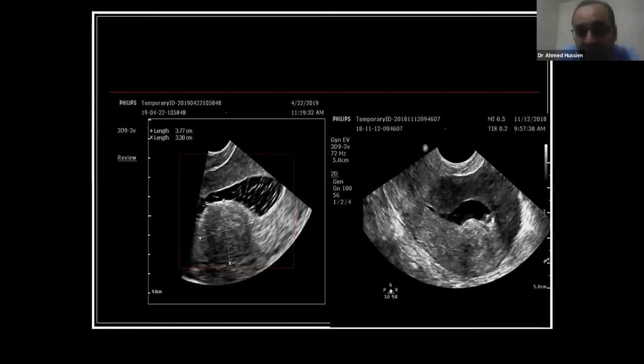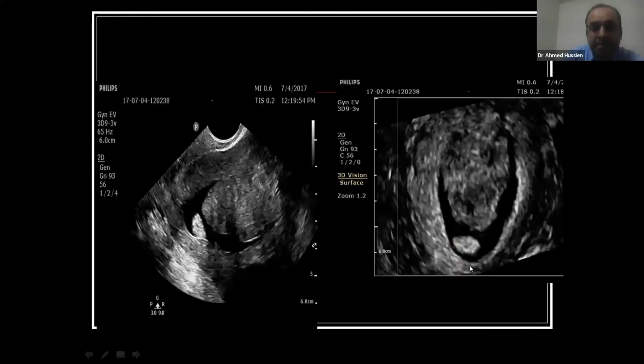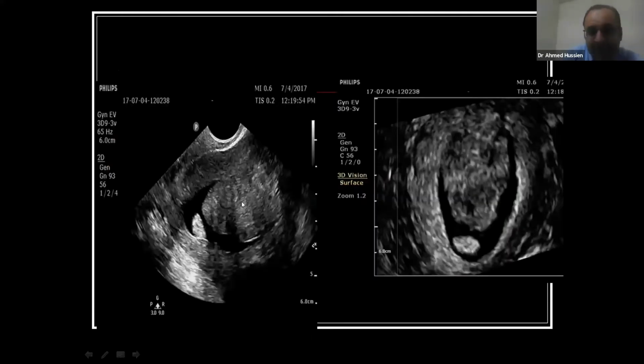With 3D ultrasound alone without saline infusion sonohysterography in the luteal phase, you can use the cavity as a contrast to know the type of the submucous myoma. The polyp may be multiple and the myoma also may be multiple. In this case, two pathologies at the same time, the myoma echogenicity different from the polyp echogenicity, the myoma echogenicity like the myometrium.